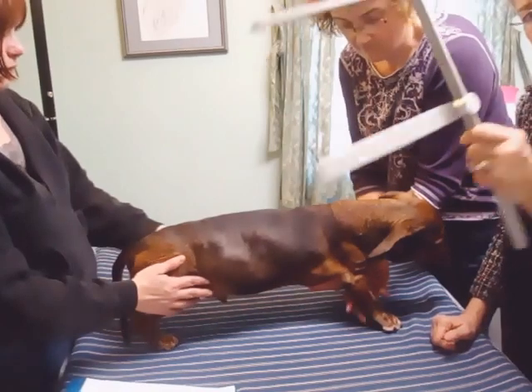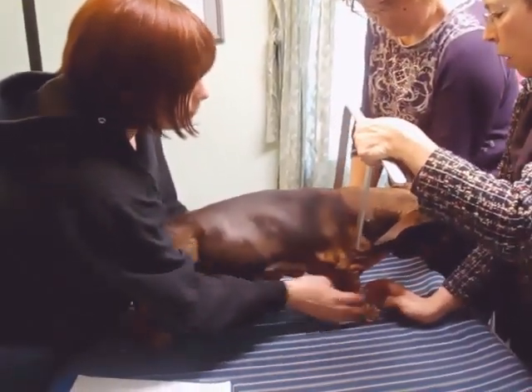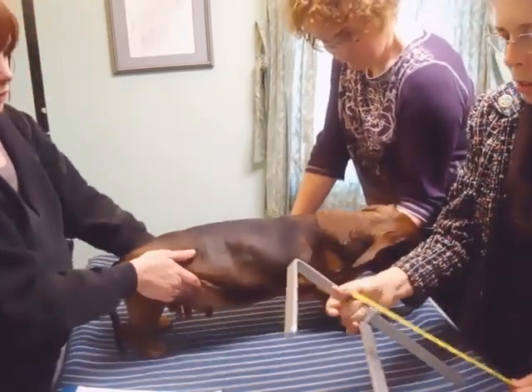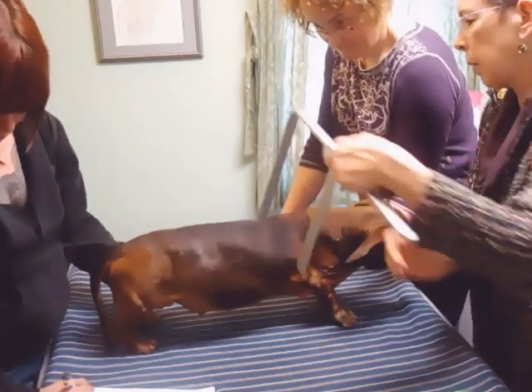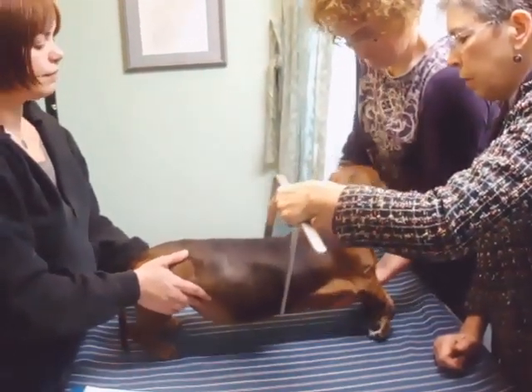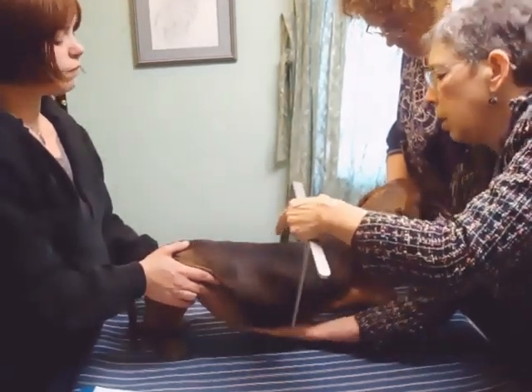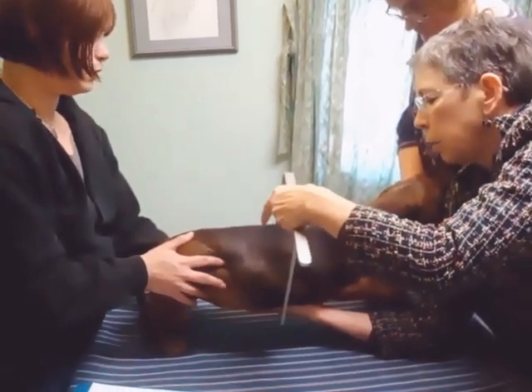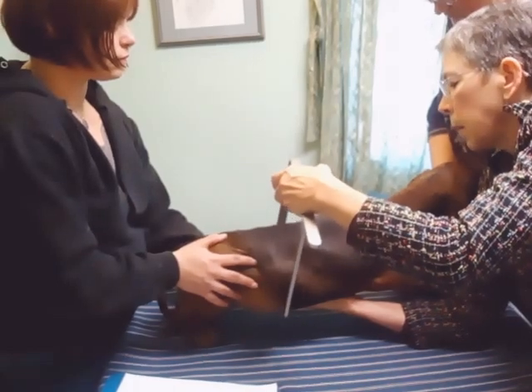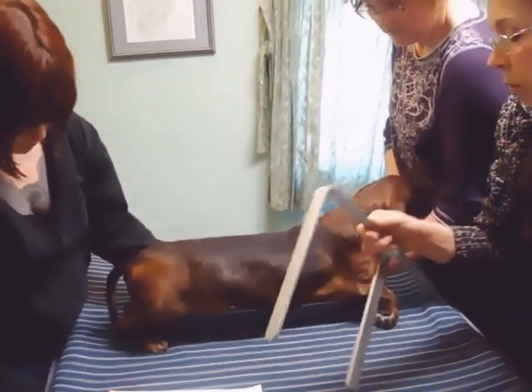This is the E measurement — we use a caliper. There are directions on the website about how to make one out of a cardboard box; you just cut two right angles. Place the arms of the caliper so it's barely brushing the fur and measure the width of the dog — six at the shoulders, then at the widest part of the ribcage. Think of it as a little wiggle room; you want a comfortable loose jeans fit. Because this dog has Cushing's and will likely bloat at some points, I want to make this one pretty loose to allow for that, and also because he's going to get pooched out by the harness. Putting my hand under him the way it will be in the cart to make sure the cart we build is wide enough — that made a big difference — it's seven and three-quarters in the middle.